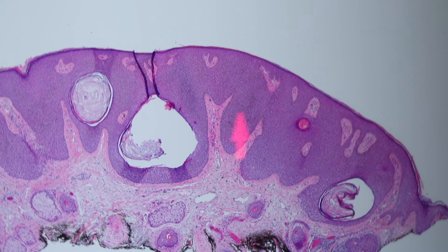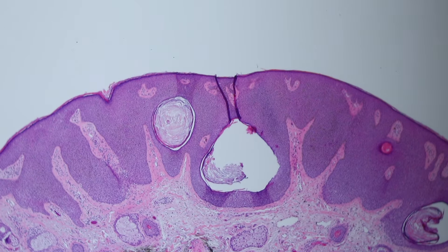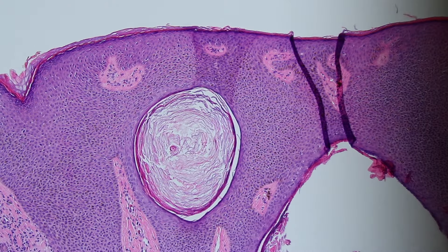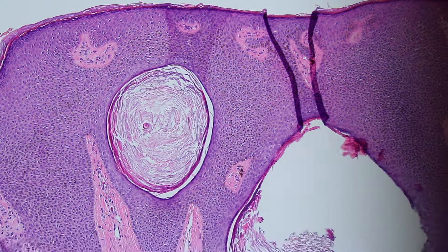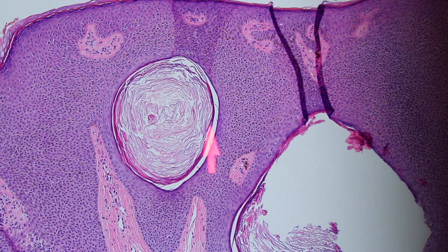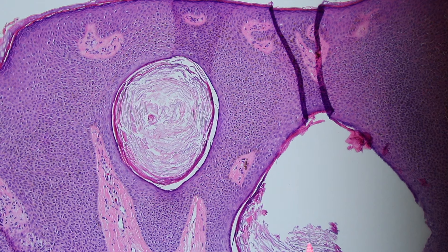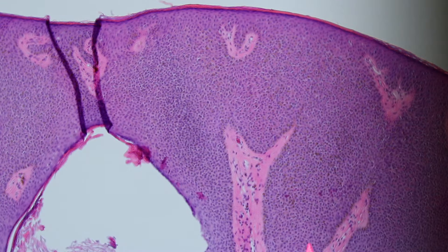They come down and interconnect, merging with each other. What is left behind are these cystic spaces filled with loose orthokeratin — dead keratin like you'd have in the corneal layer, accumulating down here. These are not really cysts but pseudocysts, because if you cut deep enough, these cysts actually connect up to the surface. It's an artifact of how we section the tissue. These are called horn pseudocysts.